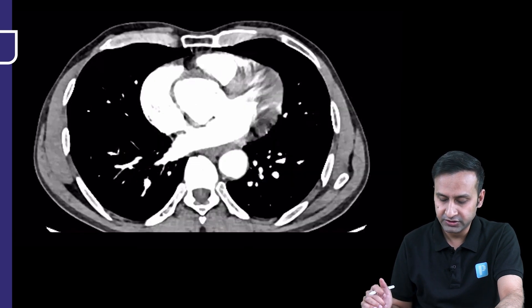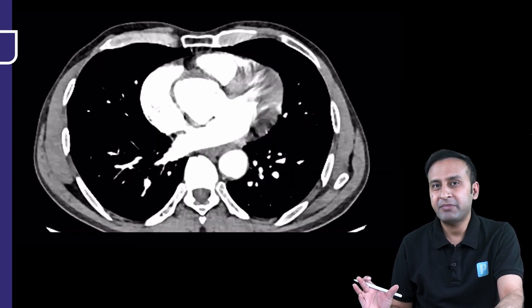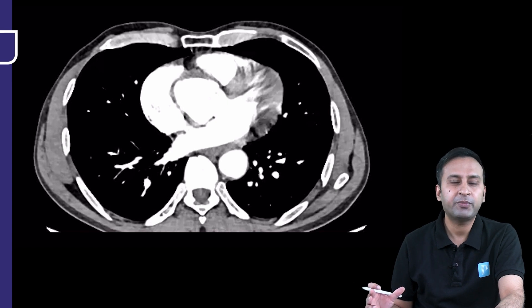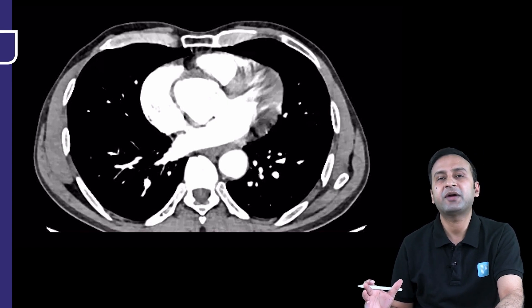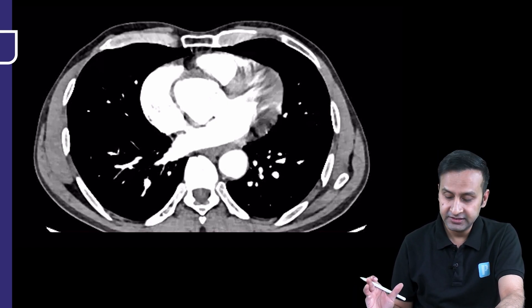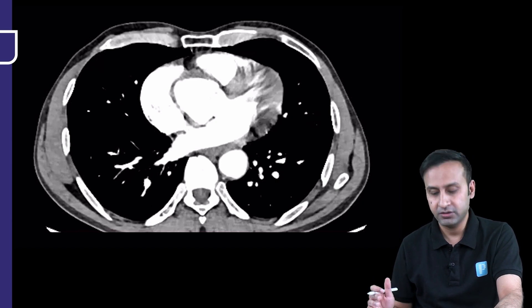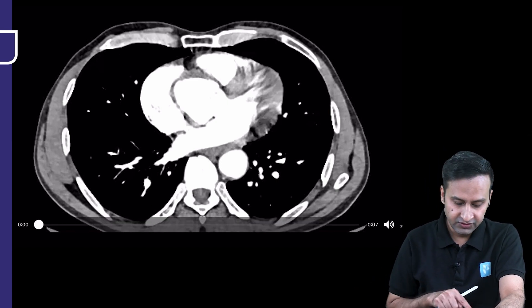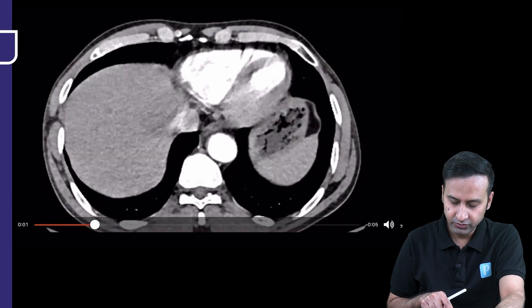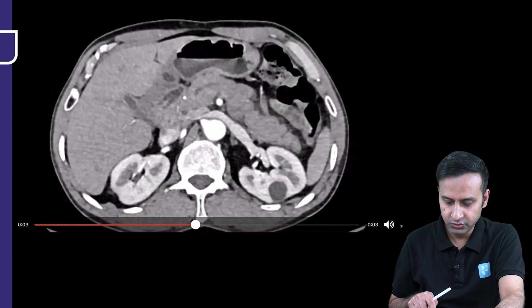Before we go ahead, let's have a look at this particular case. Since this is a case of suspected pancreatic disease and we're talking about pancreatic adenocarcinoma — pancreatic malignancy — we're going to do a dual-phase study. I'm showing you the arterial phase images first, then we'll talk about the venous phase. Let's start the cine clip, going from top to bottom. What do you see?